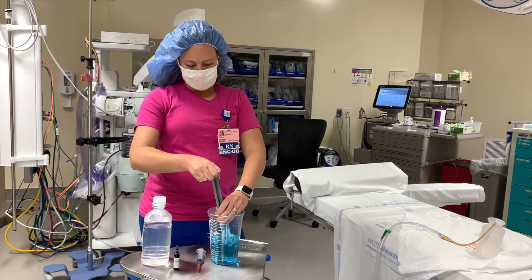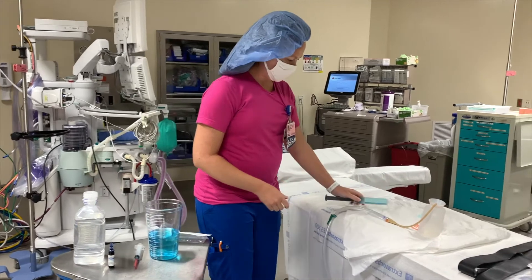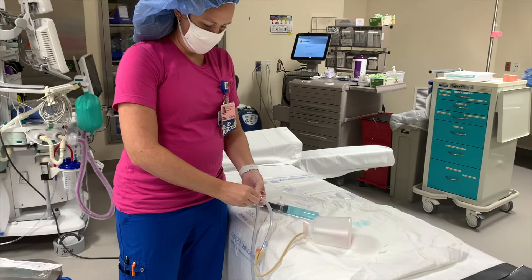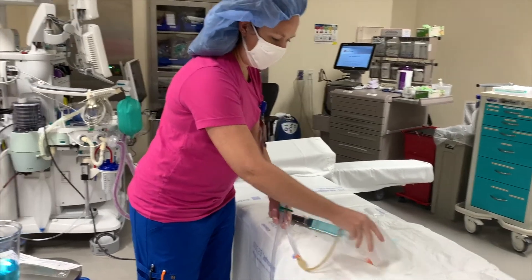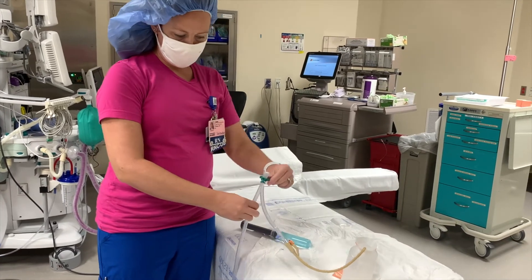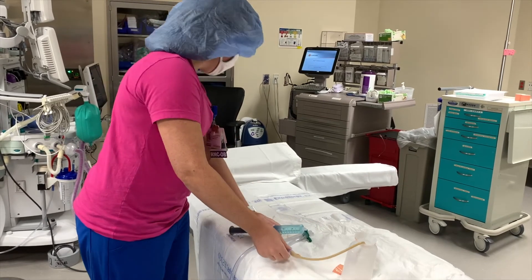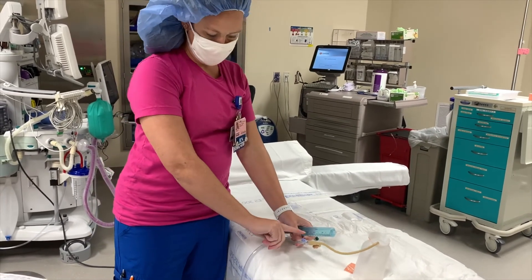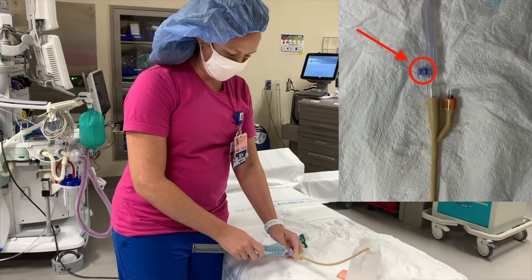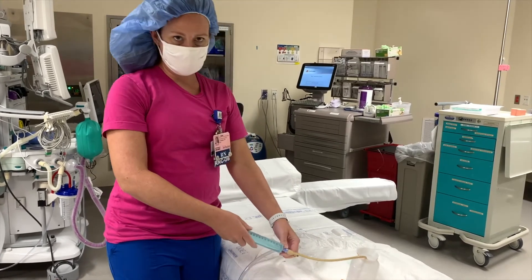You're going to draw as much of the fluid as you can with the dye, and you're going to go to the patient. You're going to occlude the tubing with this handy-dandy clamp, and then you're going to clean the port with alcohol, which I did not get. Anesthesia has plenty of alcohol if you forget yours too.